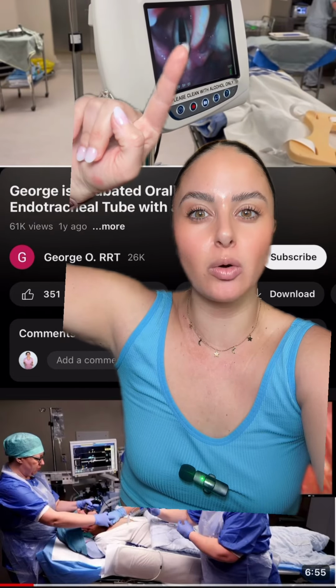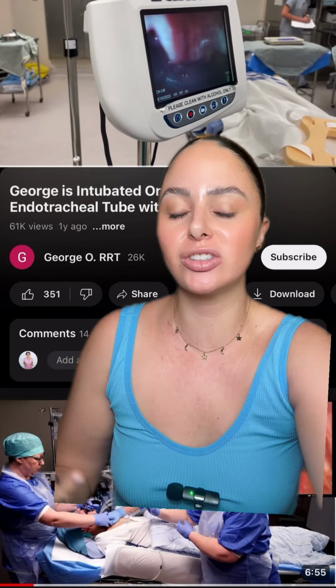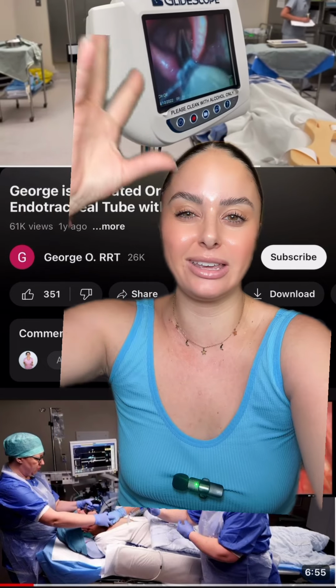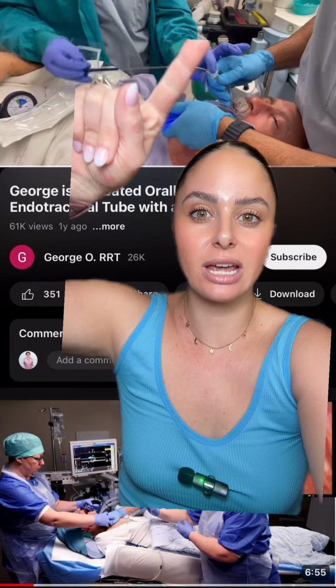You can see the patient's vocal cords. You want to go right in there. Easier said than done. This looks like a patient that's probably relatively healthy, that's getting some sort of procedure. A lot of times there's a lot of yucky gooeys in there, and so suction definitely should be set up and ready. Once the ET tube is placed, they are pulling out the stylet.